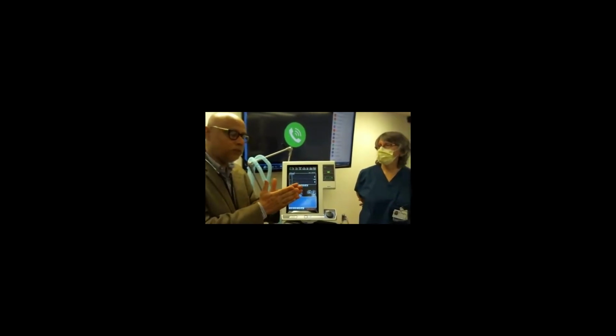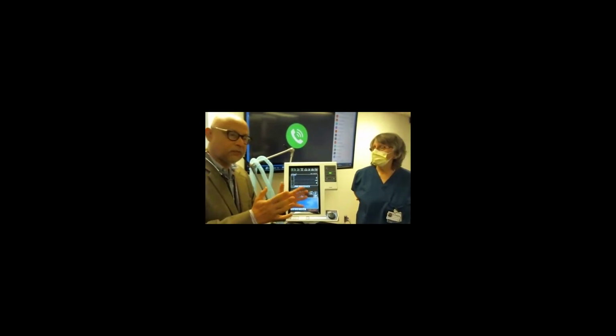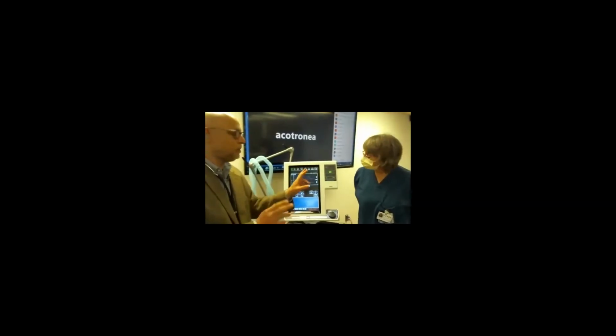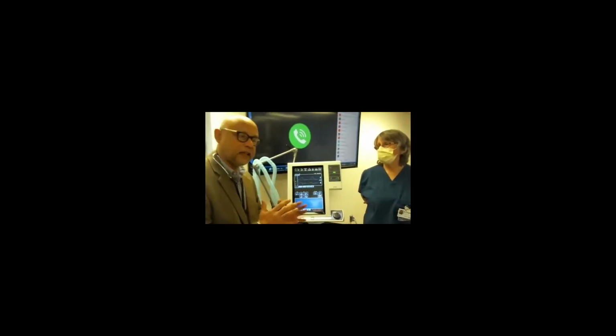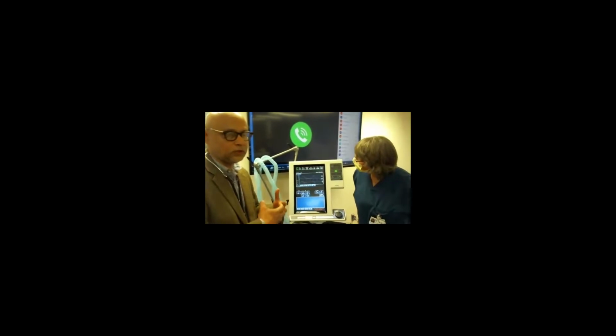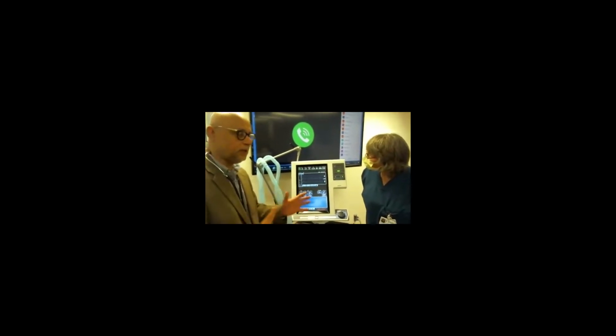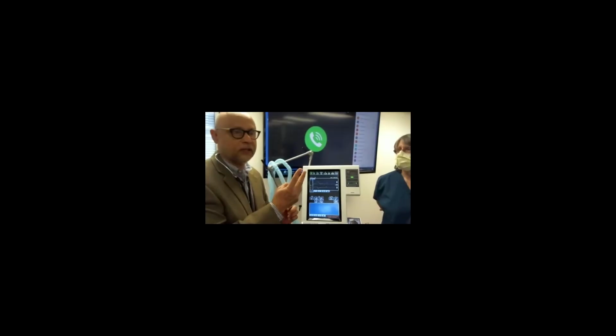We want to keep it open a little bit so that when we extend, we don't have to use as much pressure and things like that. So that's the reason we change the IE ratio. It means we give less time for exhalation. So some air stays in, and gas exchange is still happening, because not all the O2 is extracted by the alveoli. In this way, we don't have complete closure and opening of alveoli, which creates the lung damage. So we want to prevent that. That's the reason we change the ratio.